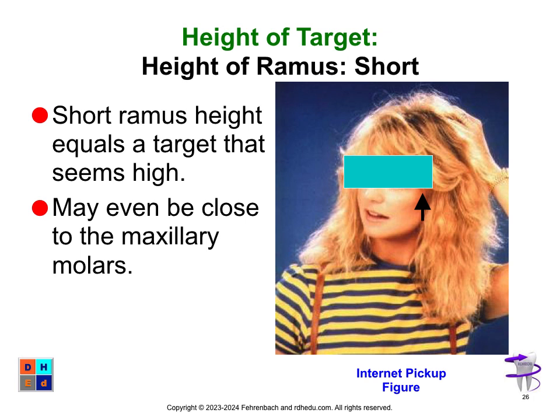No, man, that ramus was so short. She'd had orthodontia, and maybe some things happened. We all know that can happen. So I can't say that was how she was born. But I couldn't get it.